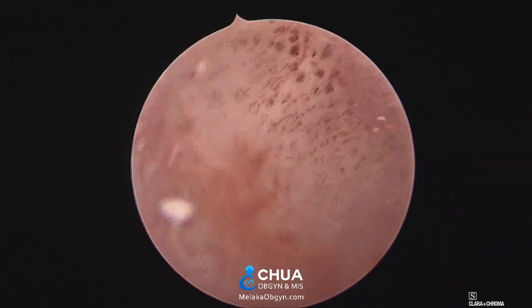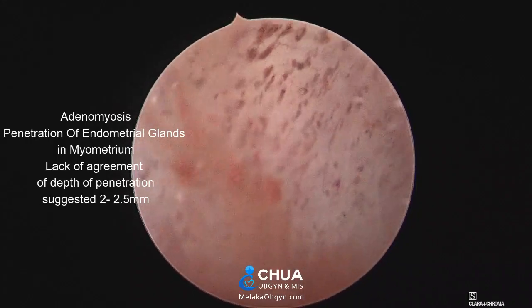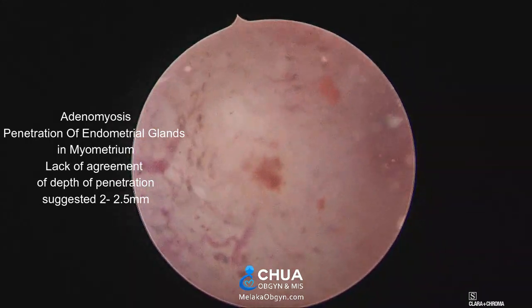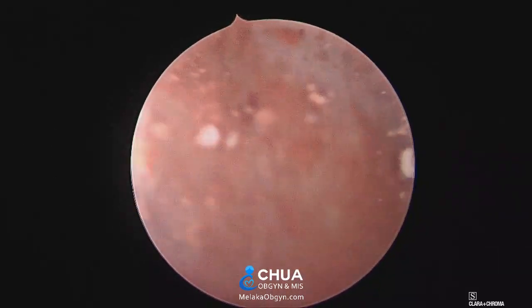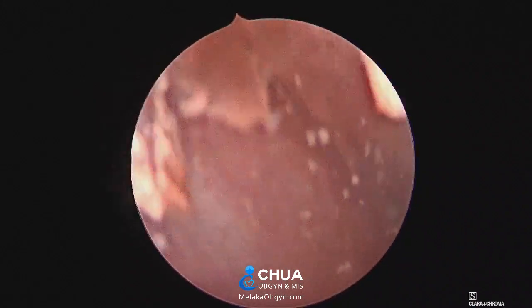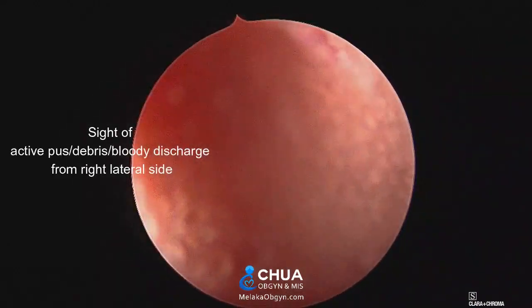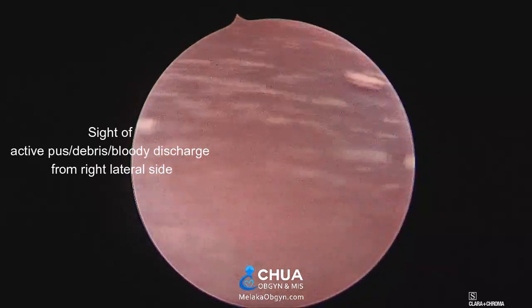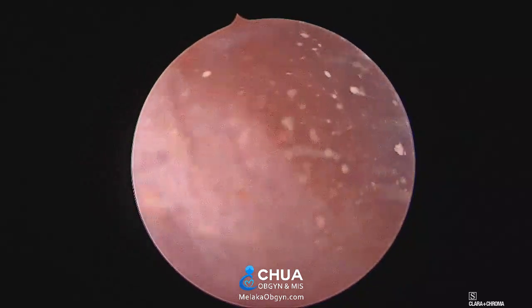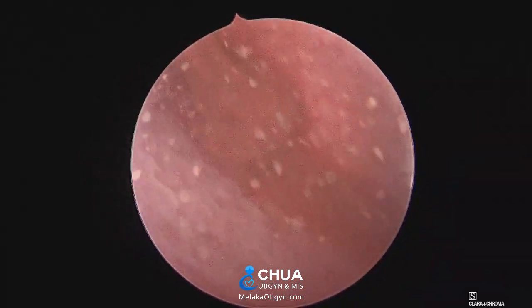You can see the left ostium here, which has been visualized, however the right ostium remains to be seen. You can note the grossly involved adenomyotic myometrium. Here is the left ostium. Once you have located the fundus of the uterus, you gradually shift from one end to the other laterally. You can see more precipitate as well as pus-like discharge arising from the right lateral side of the uterine cavity.